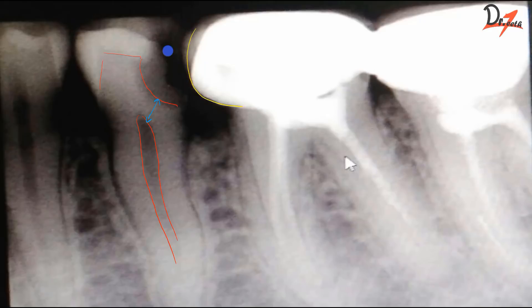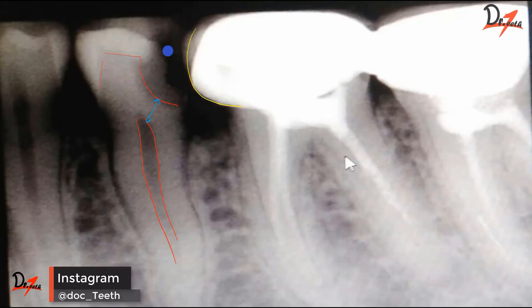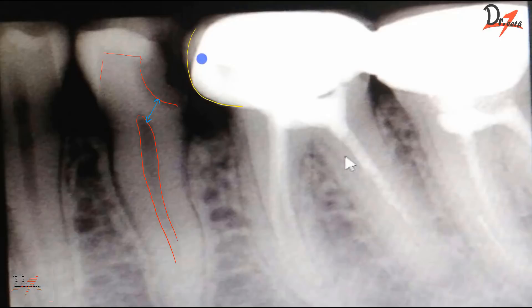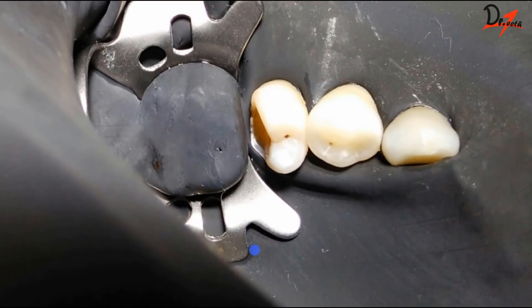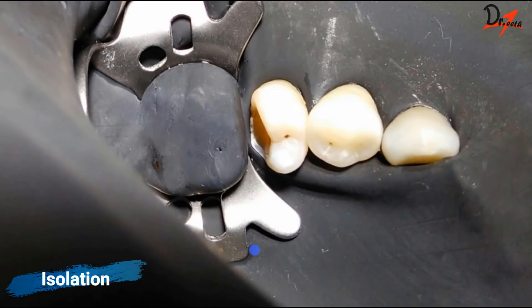The patient was advised to replace the crown, but due to financial restrictions, the patient said she would replace it later. Therefore, we started the treatment without changing the existing crown. It's less than the ideal scenario, but we will work with it for now.